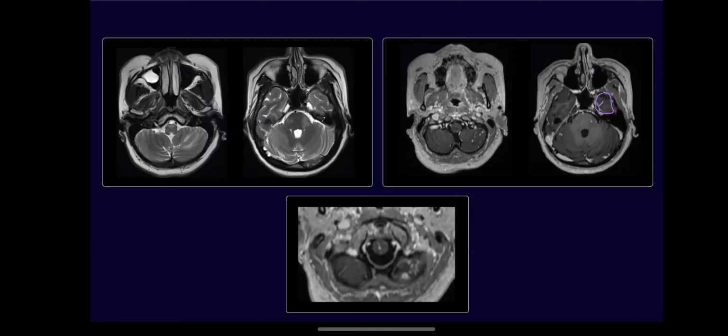So this is where, of course, again, your perfusion really helps you in picking out what could be an infection and what could be a tumor. Secondly, the MRS is, of course, very likely going to help you in being able to differentiate one from the other. And of course, the clinical history. Infections rarely have a very insidious clinical history. Of course, I will say that a lot of patients presenting with CNS tuberculosis do have an insidious onset as opposed to other organisms.